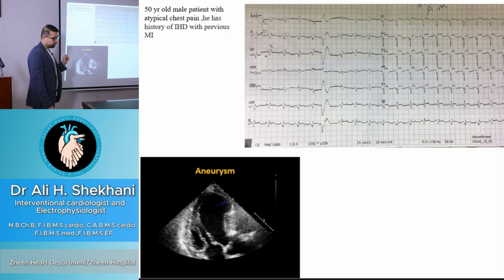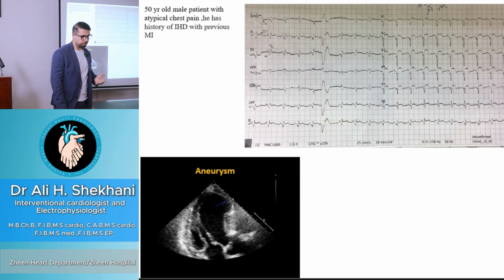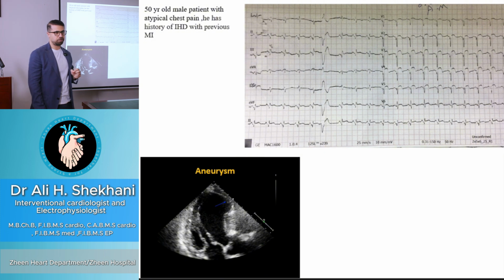So not every ST segment elevation is regarded as a new one until proven otherwise. But every ST segment elevation should be taken seriously. That's why the history is very important.